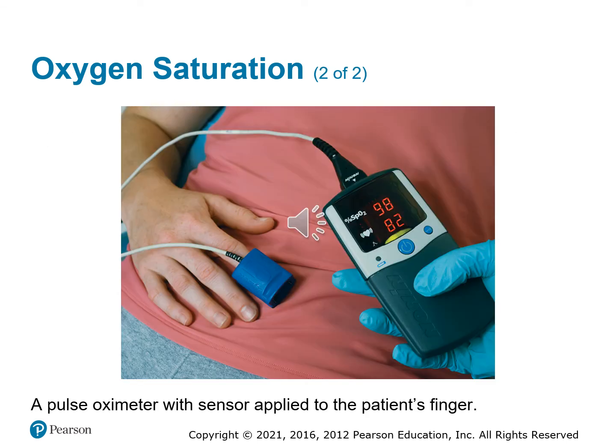Picture just showing you the common pulse ox measuring device. Usually the pulse ox will also measure the heart rate at the same time. So it'll indicate the percent SpO2 that you can see on the top of that monitor is at 98%. So very normal. And the pulse right below that, you can see it with the heart, and then little parentheses next to it. This patient's pulse rate is running 82. So good device that'll give you some accurate information.